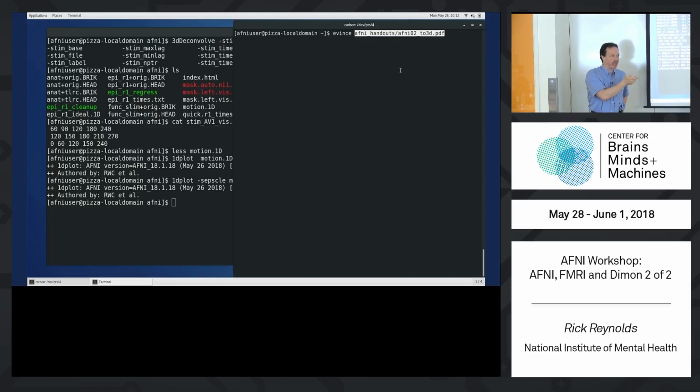They weren't the ones writing NIFTI in real time? They were not writing NIFTI in real time. They wrote NIFTI or AFNI, and then we converted it. No, we do it through their DICOM format. We're doing Bruker's DICOM to AFNI format.